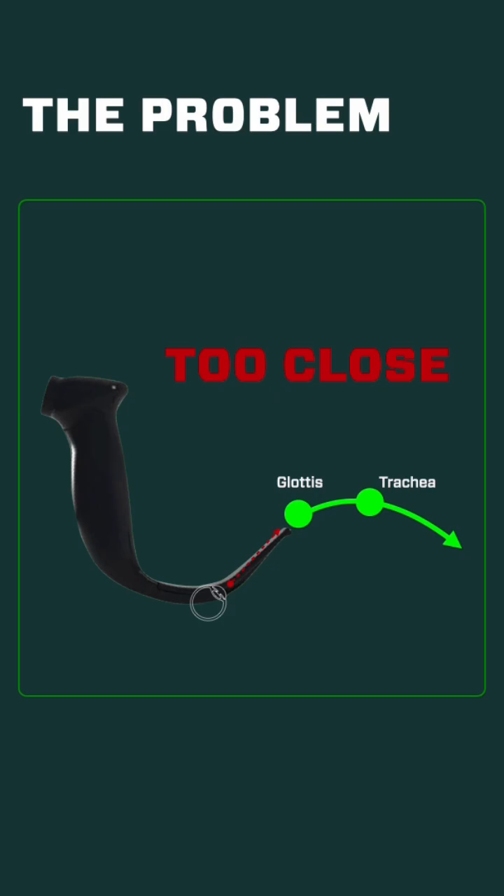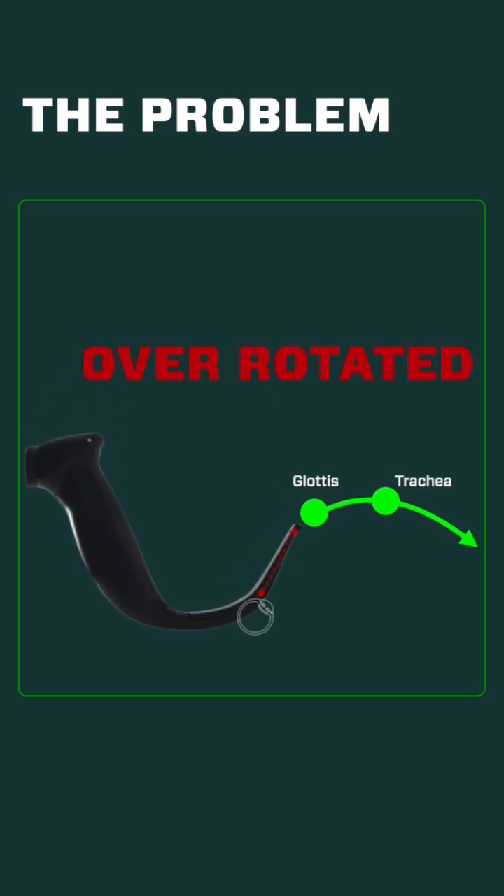Unfortunately, what most people do is they double down on this problem and they rotate the handle back towards them, and this over-rotated position just makes that angle even worse, as you can see here. So let's talk about the three easy ways that you can solve this problem.